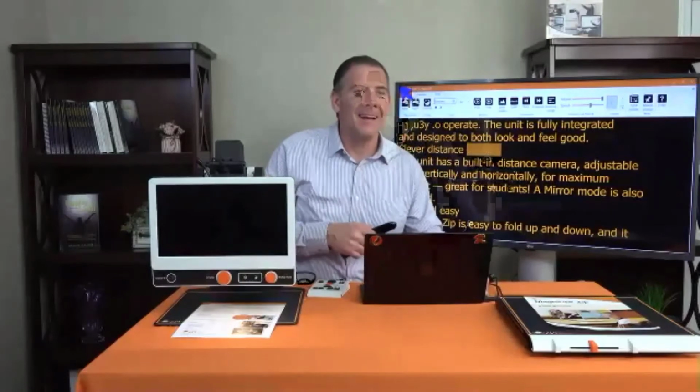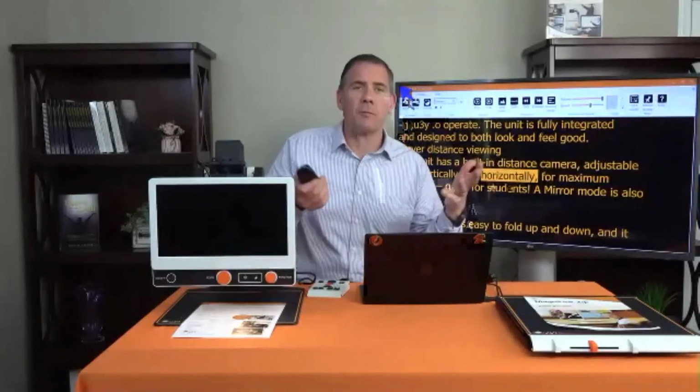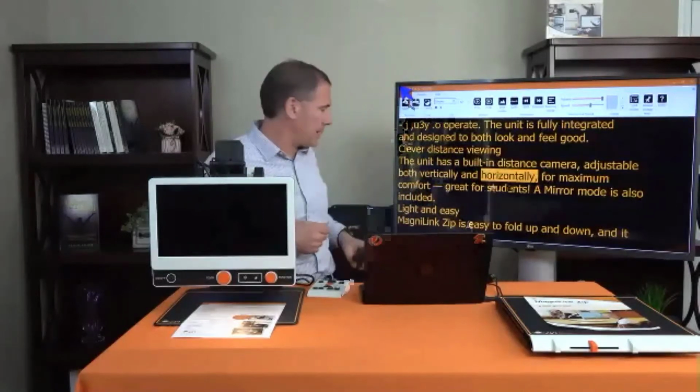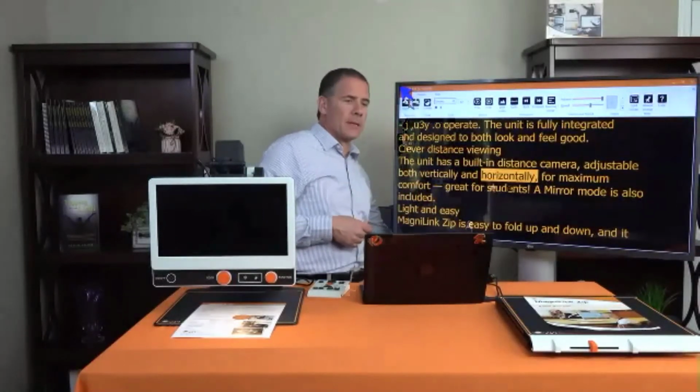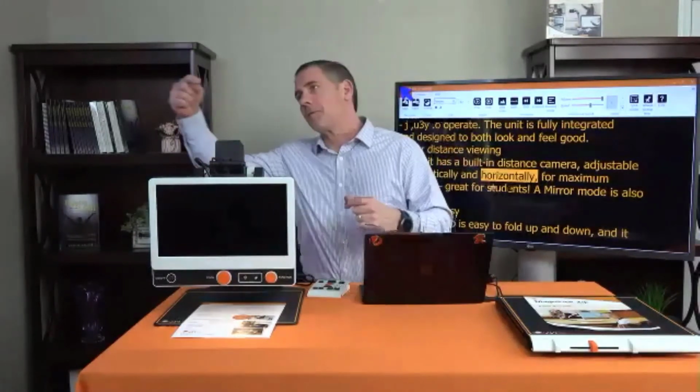Not anymore. The distance viewing unit has a built-in distance camera, adjustable both vertically and horizontally. Okay, it's reading really fast because that's how I liked it, but I'm going to slow it down now. I am going to do that with the numbers. So 1, 2, 3, 4, 5, 6, 7, 8, 9.